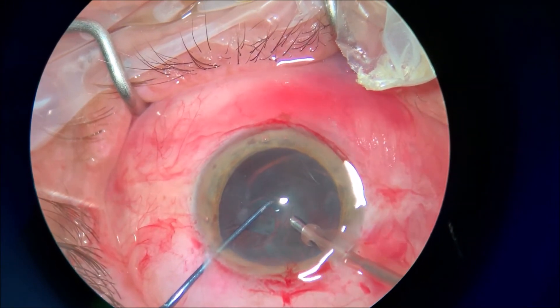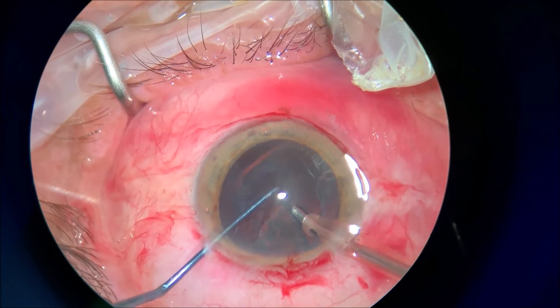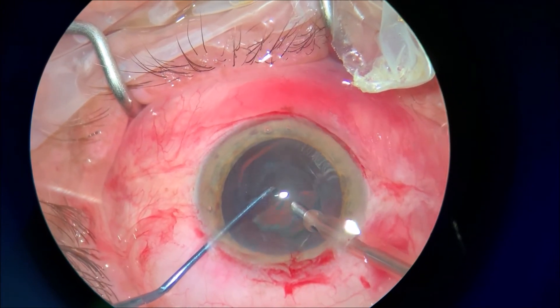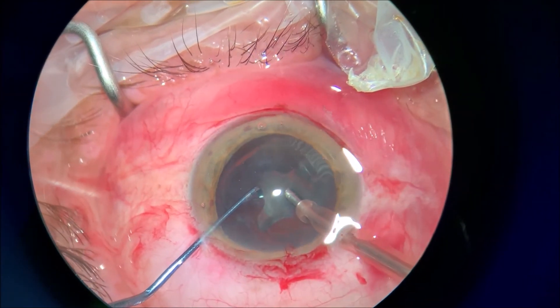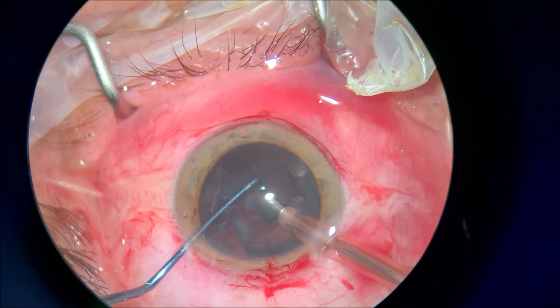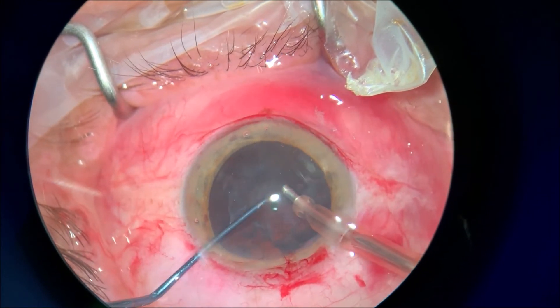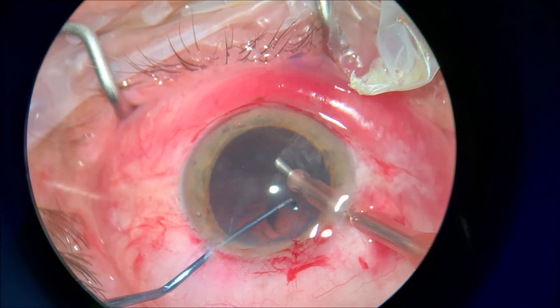Again, aspirating the thick epinucleus and cortical remnants with just the FACO probe. You have just two incisions here, and the recovery time of the cornea and the incisions is very, very short.